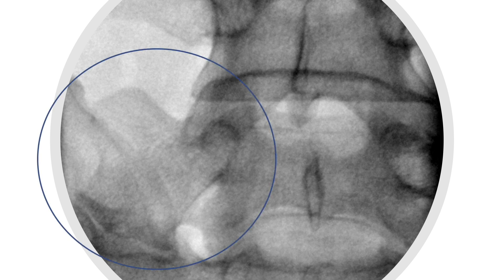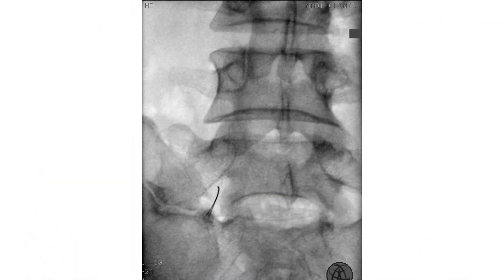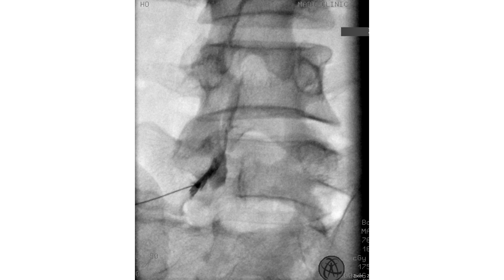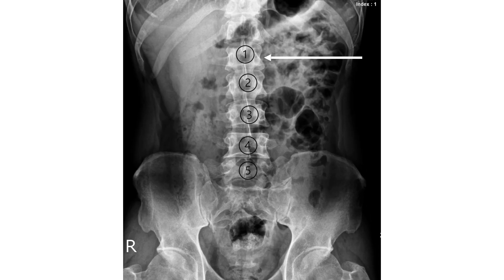The transitional vertebra is characterized by its abnormally large transverse process at the lumbosacral junction. I chose the red arrow target point as expected and put contrast to confirm the foramen and epidural space. It is a simple case of a transitional vertebra. I count down the level from the white arrow level, and L5 is the transitional vertebra.